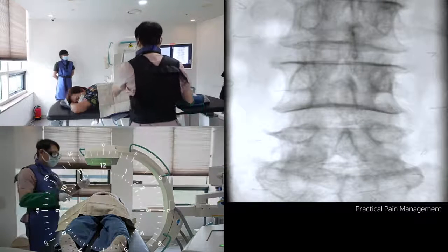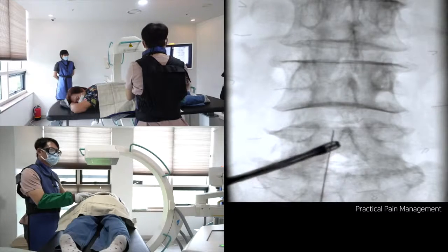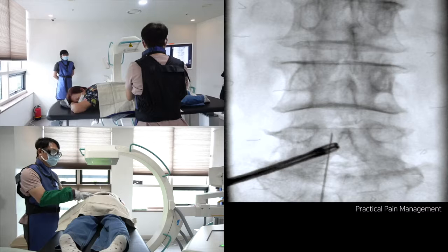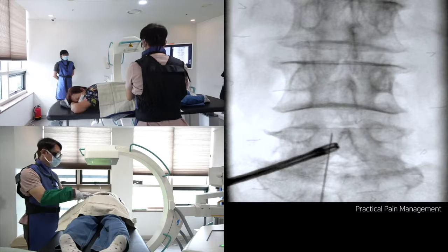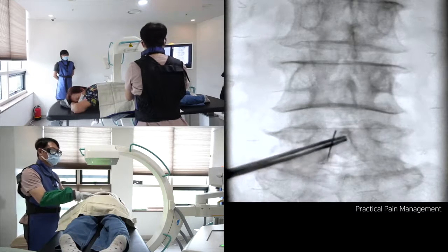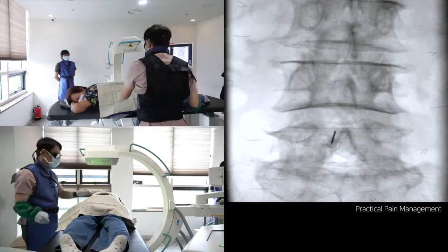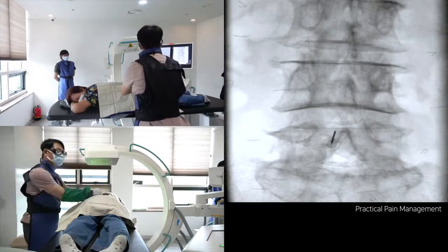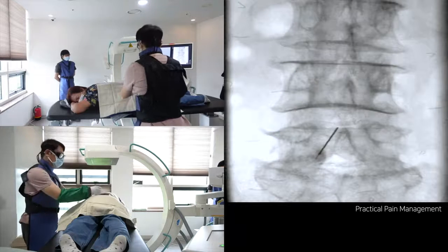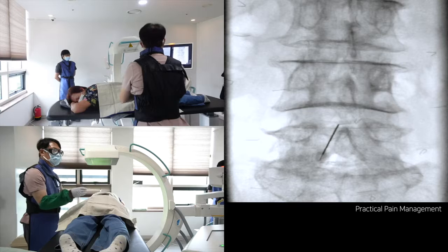I put the interest area to the lower one-third of the screen. It is an AP view in a three-degree cranial tilting state. My target is the L45 interlaminar space, and it looks clear to go. I will puncture the skin targeting the lower border of the left perisagittal interlaminar space and approach toward the midline. It is different from the blind technique.